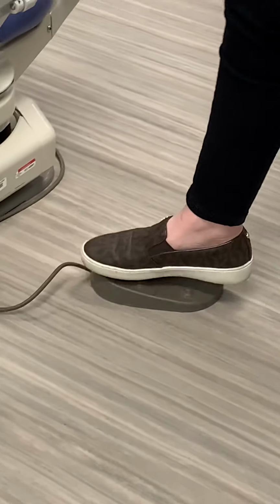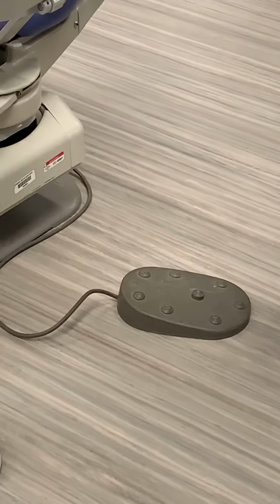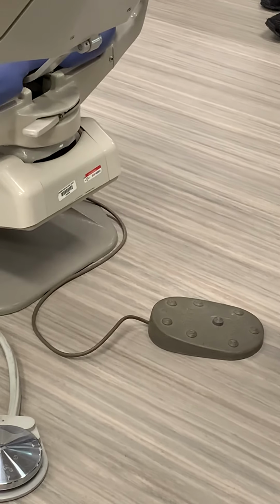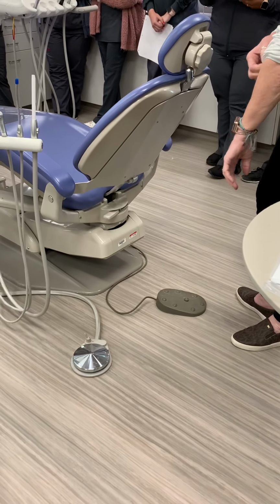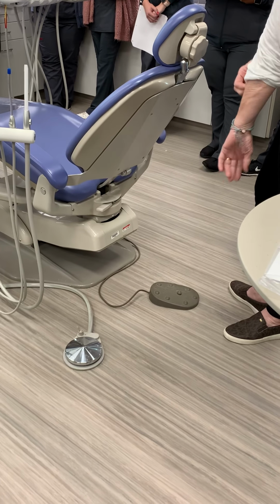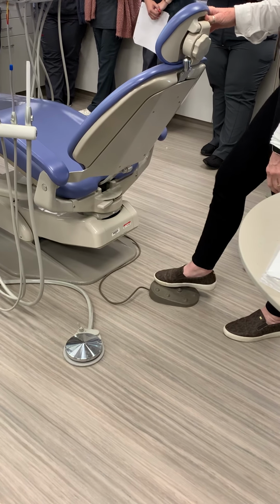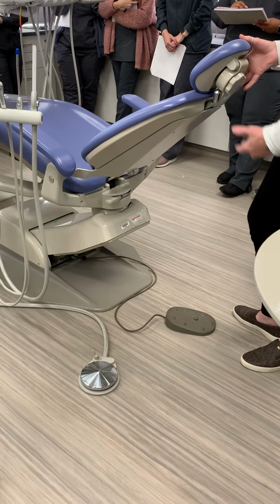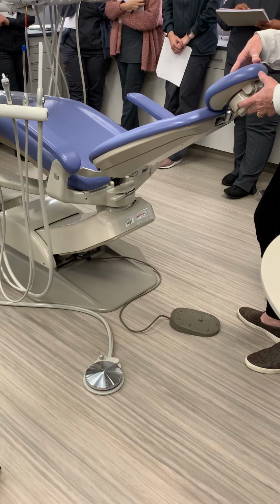So one is resting position. So when you first seat your patient, you put them in one so they wait for the doctor. You don't lay them down. The doctor could take a good 20 minutes to come in. Okay, then when they're ready to work, we go to 2. And that lowers our patient in a supine position.